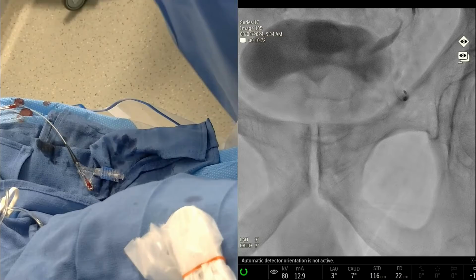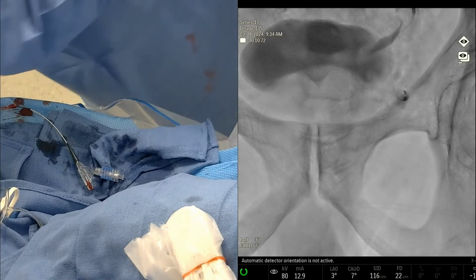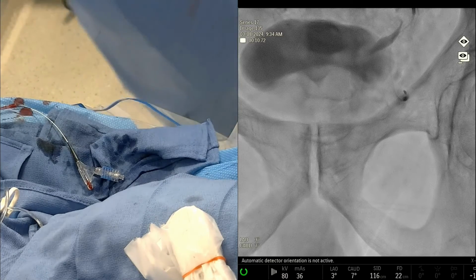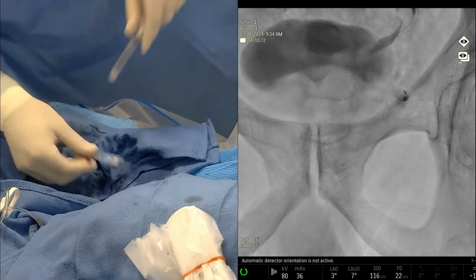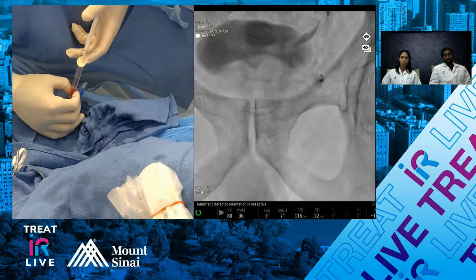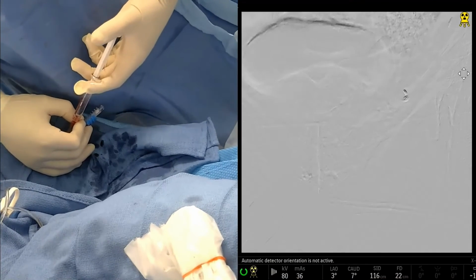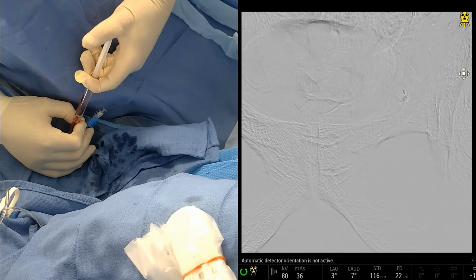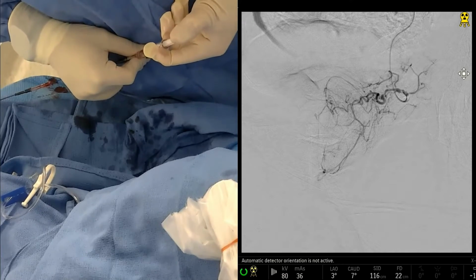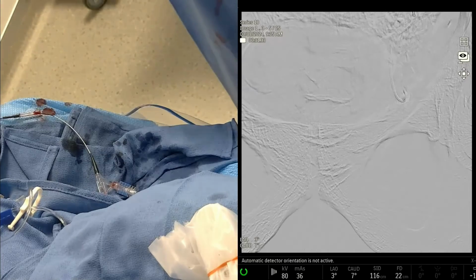Yeah. The other thing that you really want to do when you inflate a balloon in a vessel and you've changed the pressure downstream is to repeat the angio. Here, let's use a 3. Aaron, can you talk about the benefits of using a balloon occlusion catheter? Yeah, we might actually be able to see the difference if the anatomy on their side is difficult, but basically, let's see here. That looks pretty good. I'm very happy with that. I'm not worried about any non-target here.